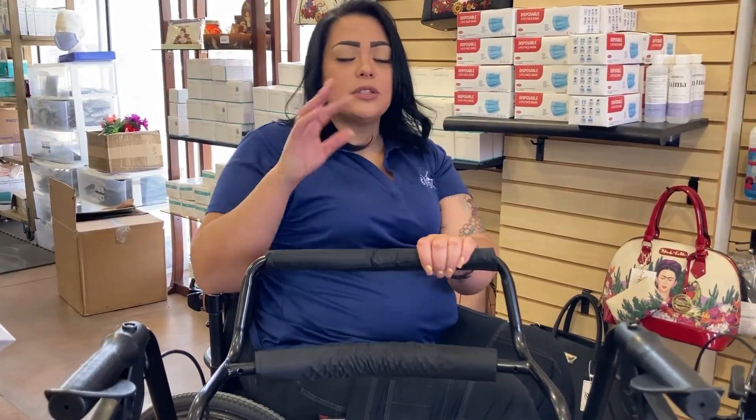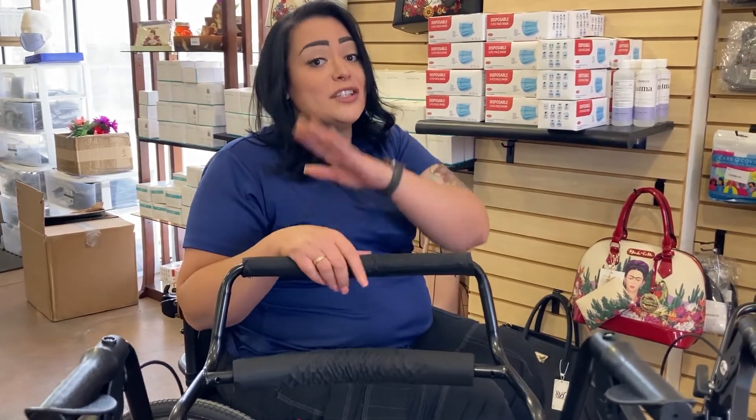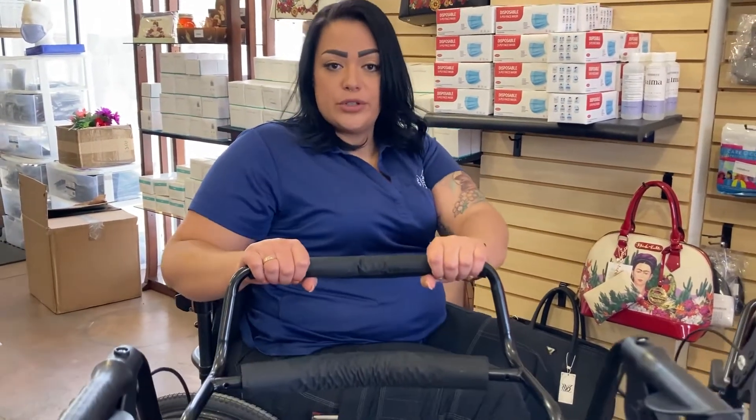Now don't get it mistaken — you cannot use this as an actual transport chair, so you cannot take this to Disneyland. But for short trips, maybe the grocery store, maybe the mall, a couple of hours, it will work. Don't take it to Disneyland because I'm not sure if this will actually take you through the whole park. So you can sit right here and then the person will be able to push it from the back.